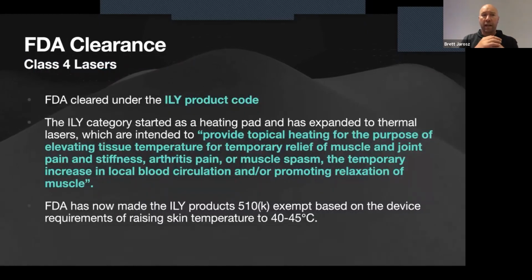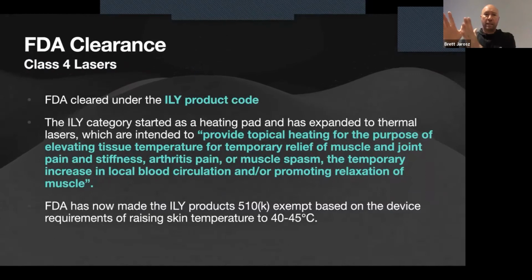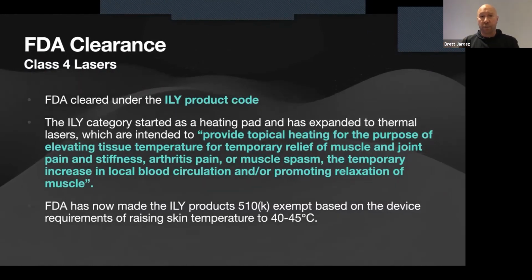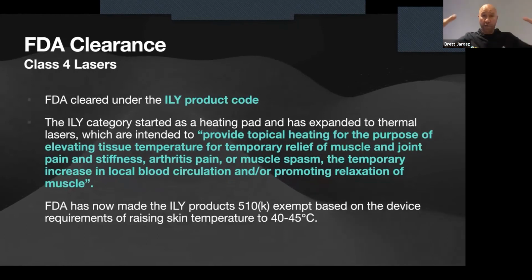Then we talked about the FDA clearance aspect as it related to class 4 lasers. And again, when I was going through a lot of these aspects, I'm going to share the case study that put me on this path to why we're here today. When I started looking into some of these components, these were all the fascinating things that appeared to me in this confusing umbrella of that term photobiomodulation, and how we have LED, low-level laser, infrared laser, high-intensity laser, etc., all under that one umbrella term of photobiomodulation, but it's all different, even though it's under that one label.